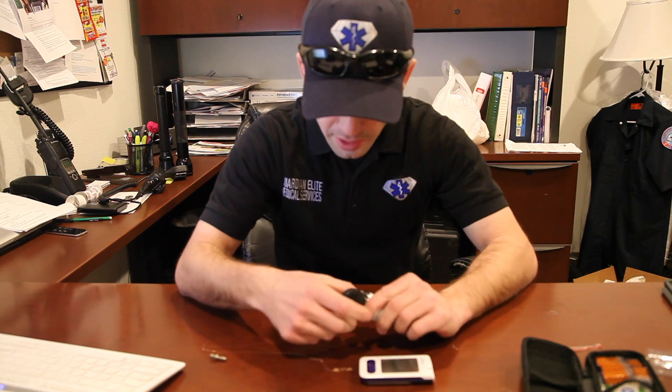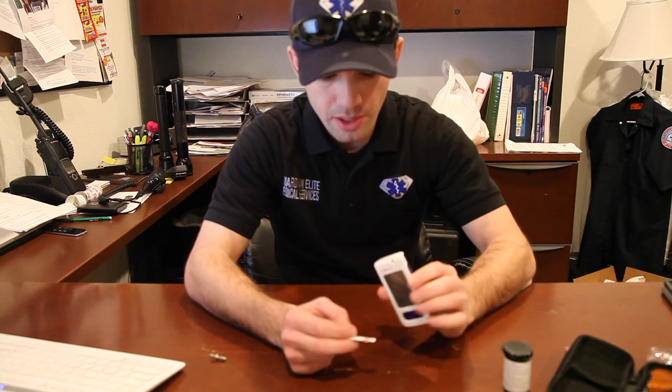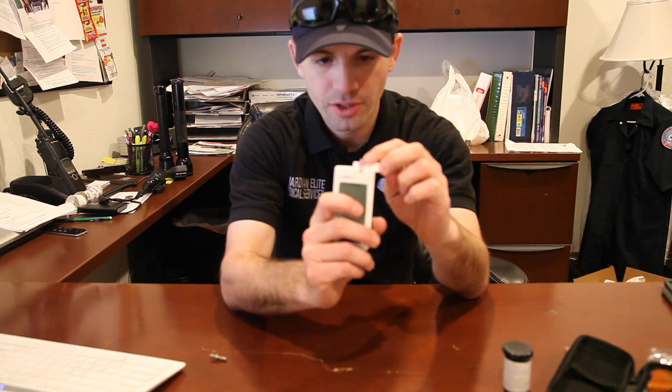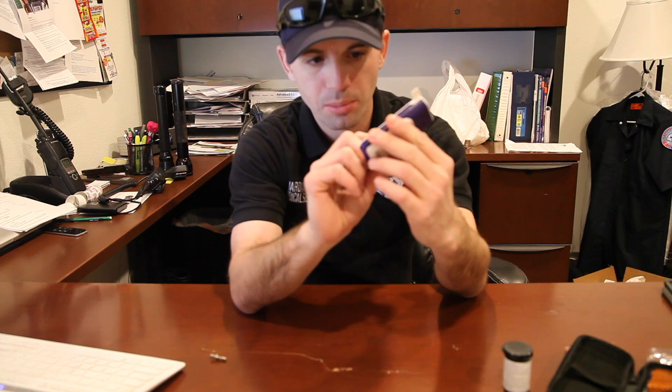Then what you're going to do is get your glucometer set up. Before you do anything, take your test strip out of your case and put it in the glucometer. The way the Quintet AC glucometer works is the test strip actually goes into the side, and the glucometer will then turn on and tell you that it is awaiting blood.